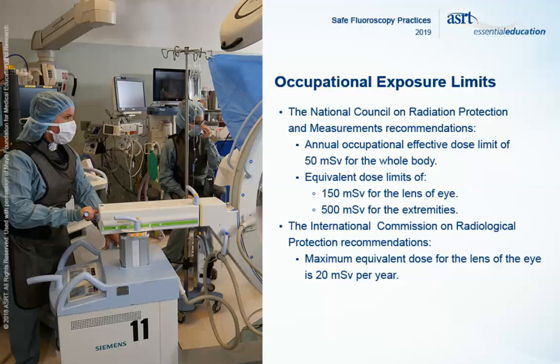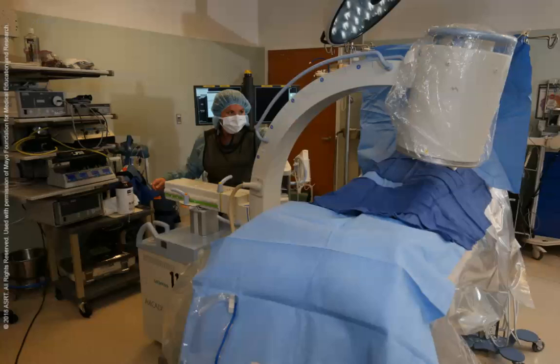Thus, the proper use of radiation by operators of fluoroscopy units is critical, and personnel must have appropriate training concerning the potential for radiation exposure during each examination. Operators and personnel should always keep their hands out of the path of the X-ray beam and maintain as great a distance as possible between themselves and the source of radiation.